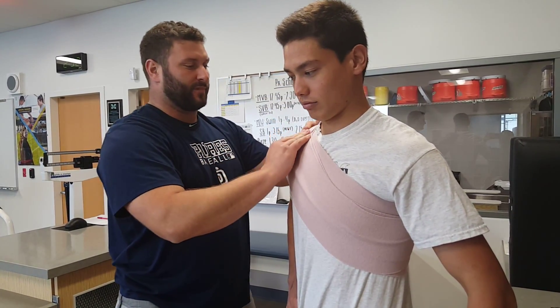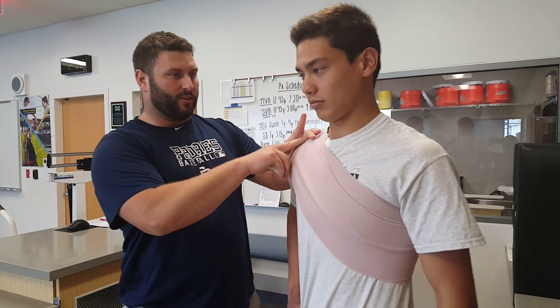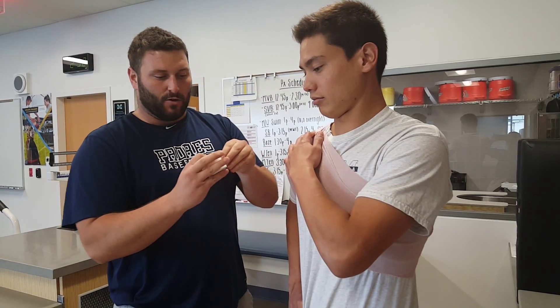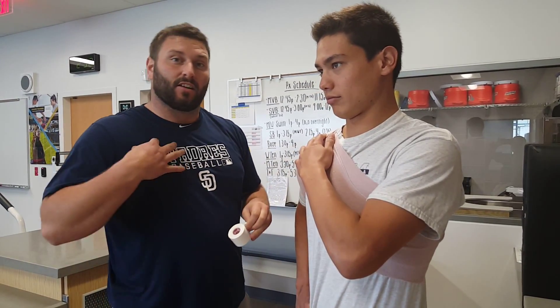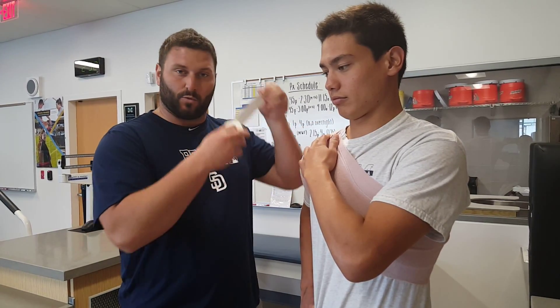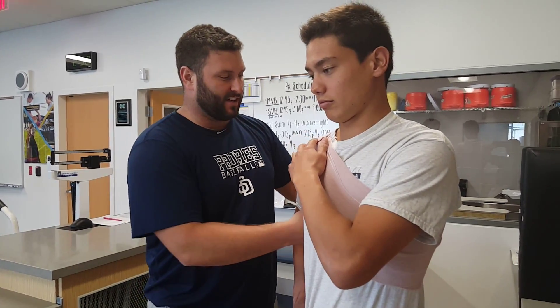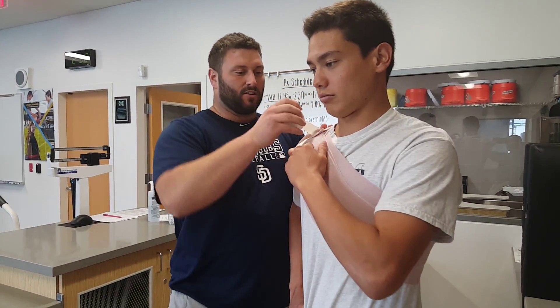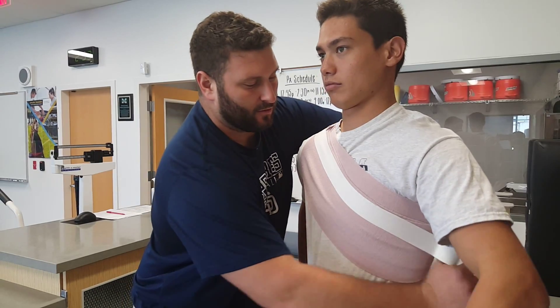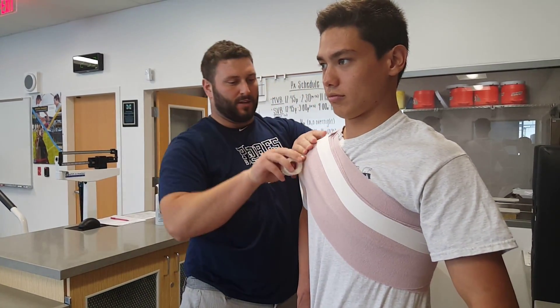I've run out of the elastic wrap, so I'm going to tape that off — can you hold that in place for me? This can also be used if we need to ice the shoulder. If we're going to ice then we can just tuck it in, but if he's going to play in sport then I'm going to go ahead and tape it up. You don't want to tape too tight — you don't want to cut off the blood supply. Go around to help keep this secure.